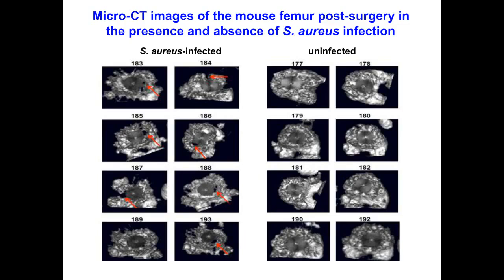So we overlay everything here with the bioluminescence and the micro CT, and you can see in this media clip exactly what this looks like.